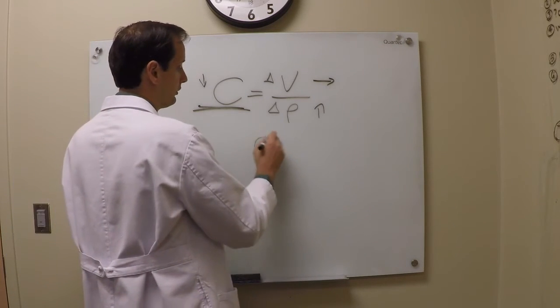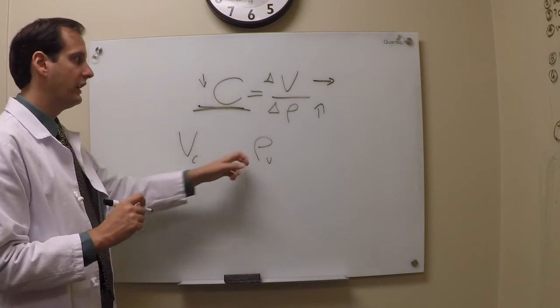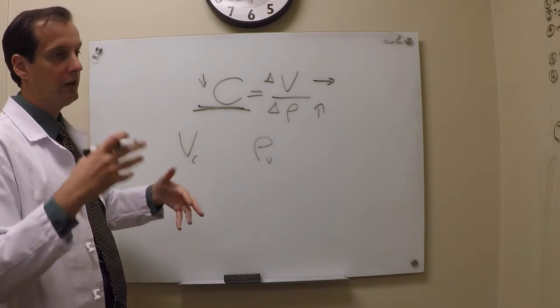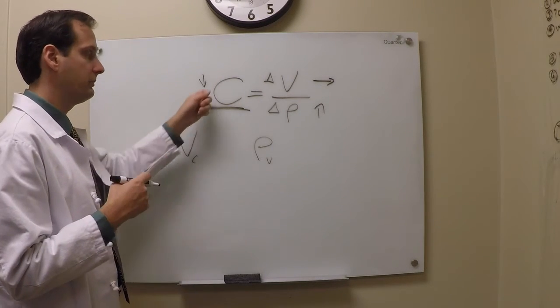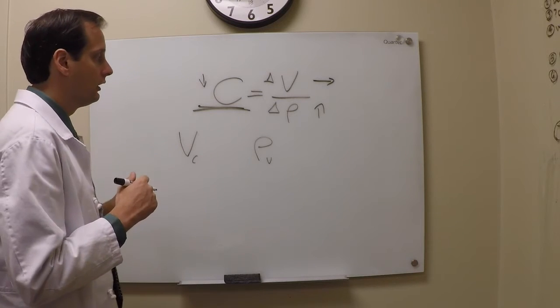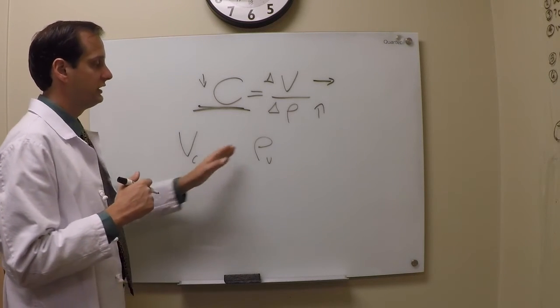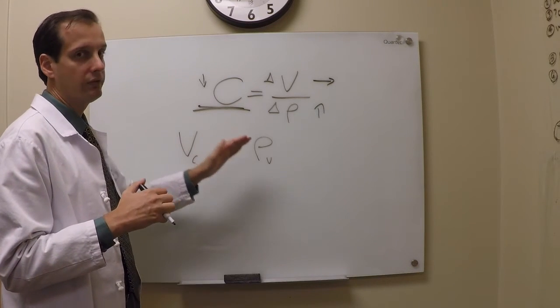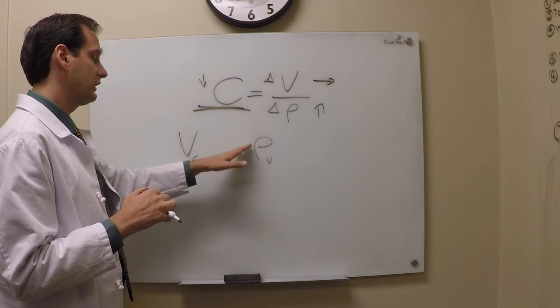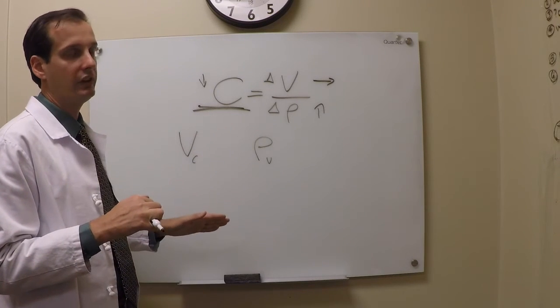As a result, your pressure is variable, and it's variable based upon breath to breath resistance within the chest, synchrony on the vent, amount of compliance within the tissue, all of these different things. Because your volume's constant and the pressure is variable, you run the risk of injury, you run the risk of barotrauma, you run the risk of volume trauma. And that's the trade-off. You get certainty in ventilation, you have uncertainty in safety.